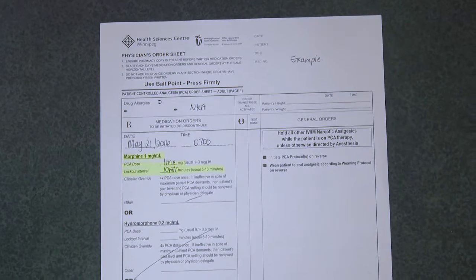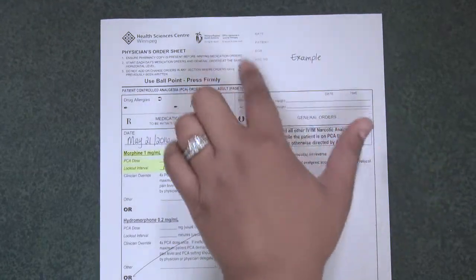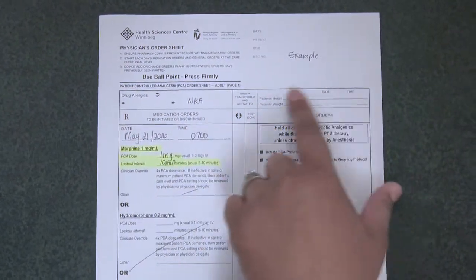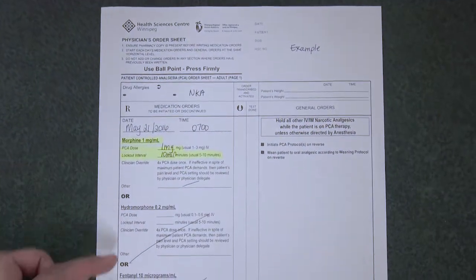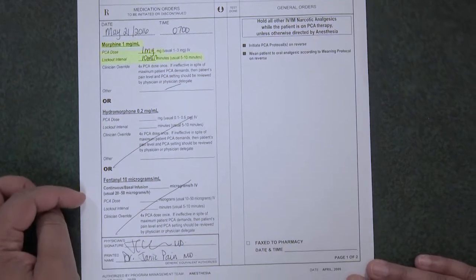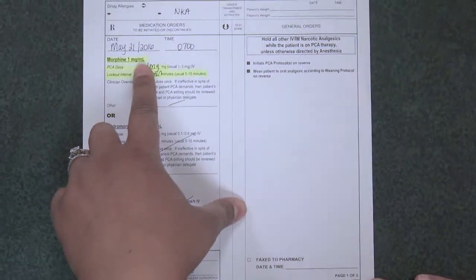So this is an example of a physician's order for a PCA. You can see here you'll have your addressograph at the top, you have your drug allergies, and typically you'll have your height and weight. You have the date and the time. The format here is very similar, so you're already given 3 medications that you could be administering. We're going to be using morphine, 1 milligram per ml.